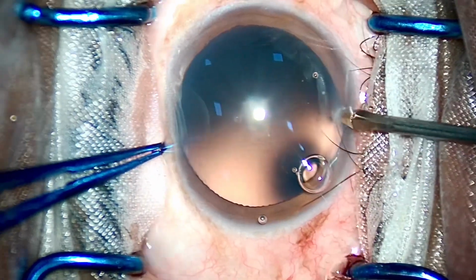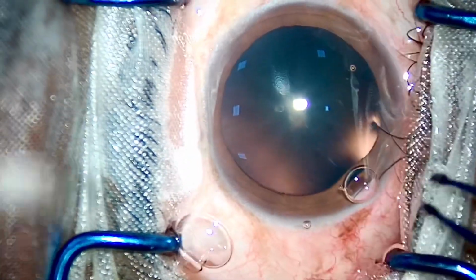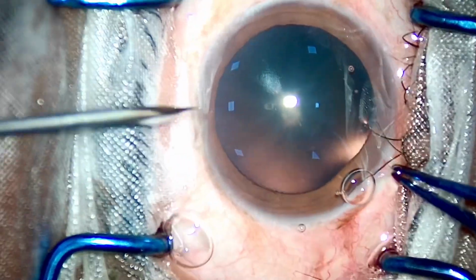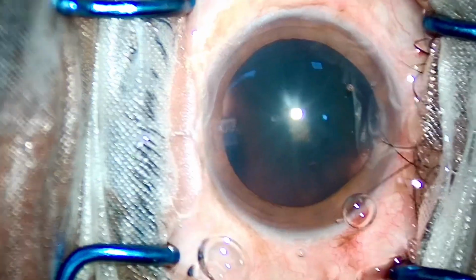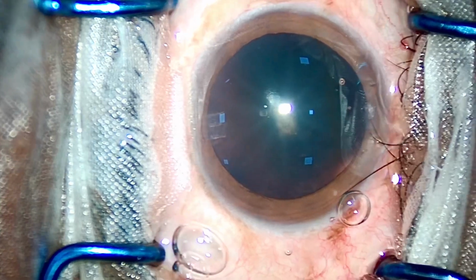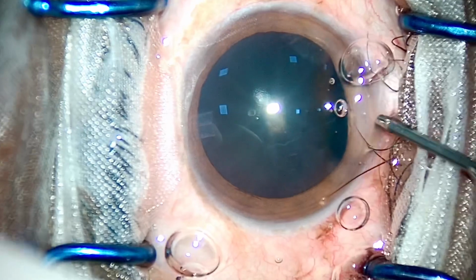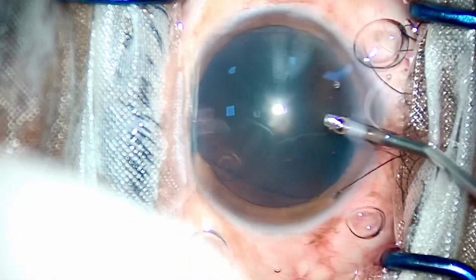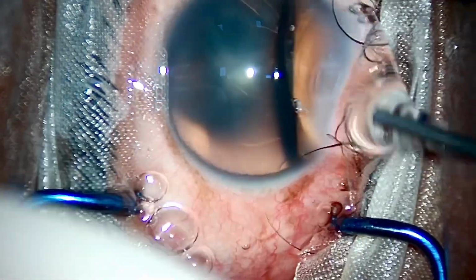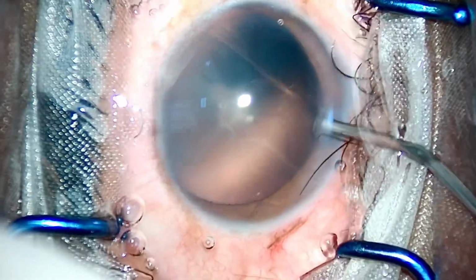Hello, colleagues. Today I am going to present you a case that shows what astigmatically neutral incisions are. What is astigmatism? As we all know, it is the difference in K1 and K2 readings. As you all know, side ports have not been known to cause surgically induced astigmatism, but the main port has been known to cause certain degrees of SIA as we call it.